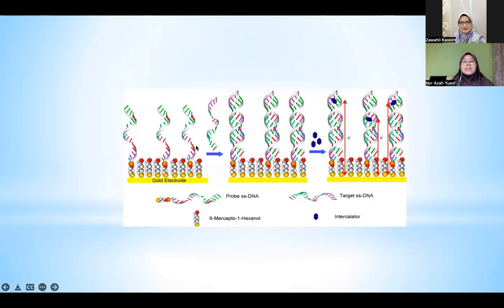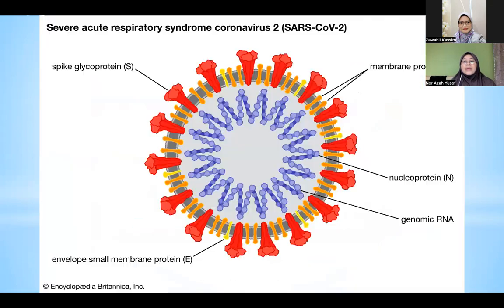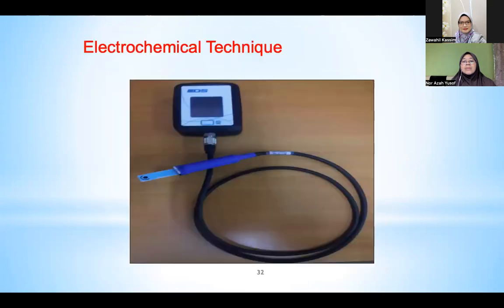So imagine this. This is the DNA probe, specific to dengue virus, for example. And then we have extracted DNA from the virus, from the sample. If it is a perfect match, we call it the target DNA. For this DNA to form a double helix, or to hybridize, it requires some space. If we put too many things on the sensor surface, this process will be hindered, disturbed. So you're not going to get good results.